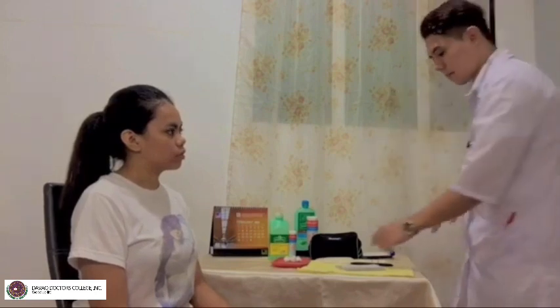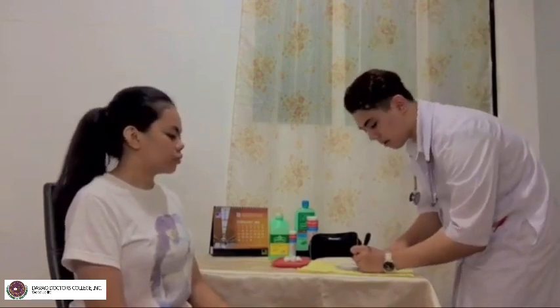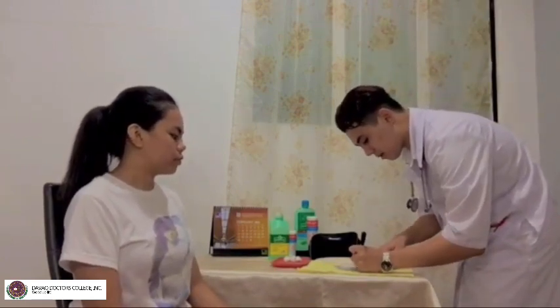During deep respirations, a large volume of air is exchanged, and during shallow respirations, a small volume is exchanged. Normally, respirations are evenly spaced, and respirations are silent and effortless. Okay, so now I just need to document this, ma'am, okay? Do you have any other questions?